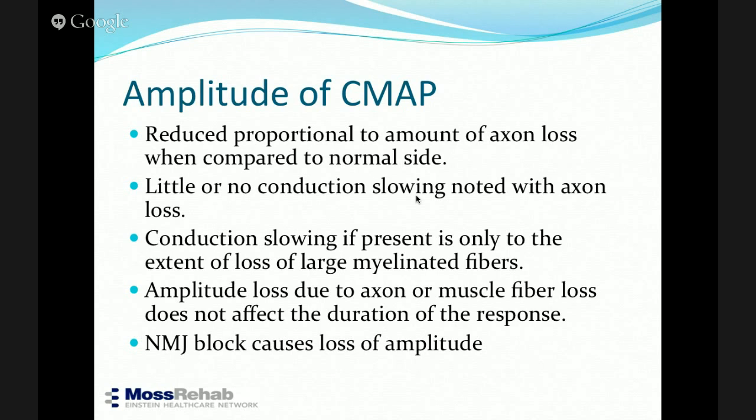Right? Remember, in a curve, you have the mean, and you take two standard deviations, which covers only 95% of the amplitudes, and 95% of the latencies, whatever. So somebody could be outside those norms and still be normal too. What is normal for that person is important. Think about that, okay?